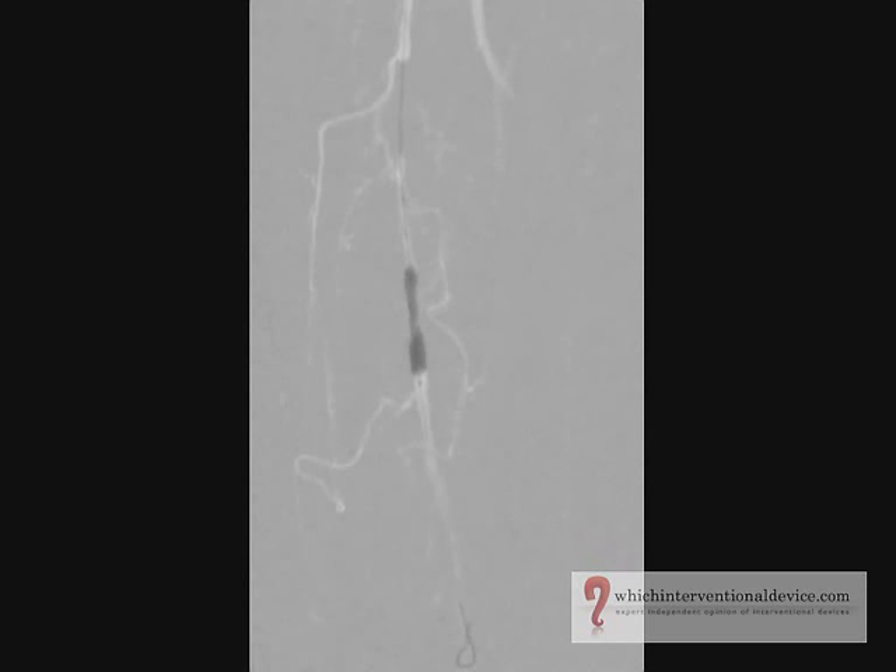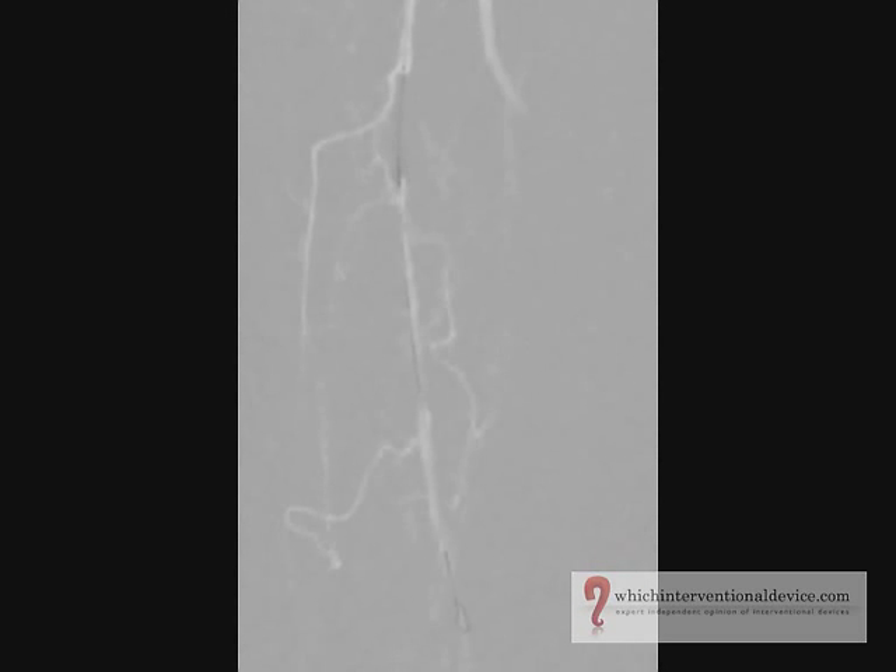This is then inflated using a pressure inflation device due to the high pressures required in tight stenosis and occlusions such as these. The balloon is then deflated and the more proximal occlusion is dilated again to 6mm. The roadmap demonstrates the correct sizing of the balloon.